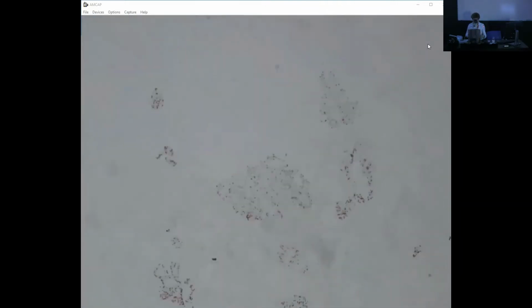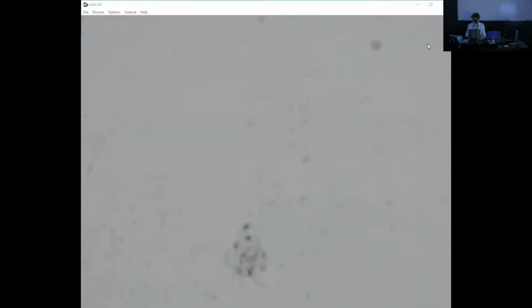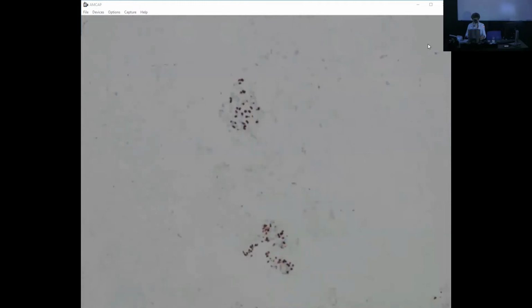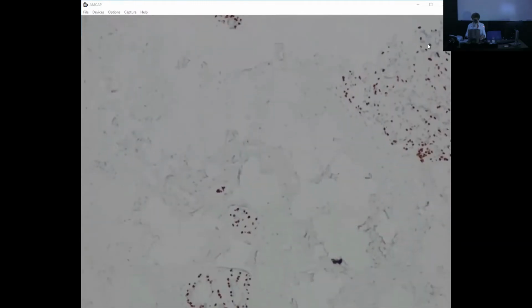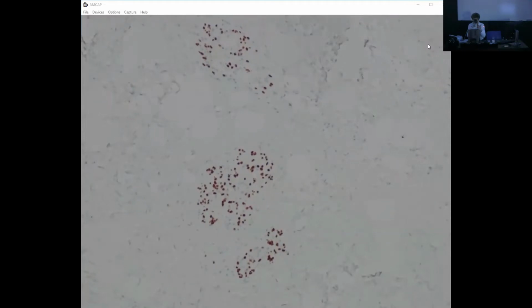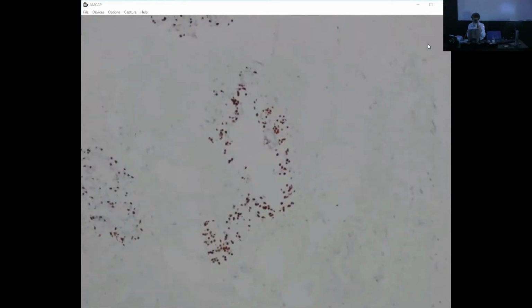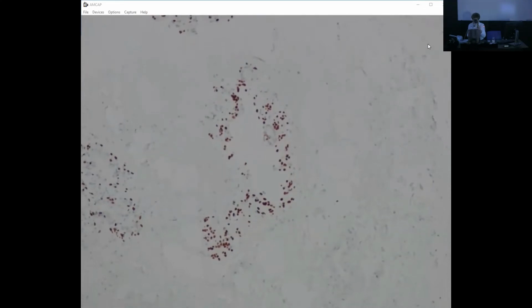Yeah, it's really very focal, seems to have been almost wiped out. But yes, there is myoepithelial proliferation, myoepithelial hyperplasia in this case, but no lobular neoplasia. Here is a good example. It's a demonstration of how sometimes the myoepithelial cells can mimic in some ways lobular neoplasia. This is an elderly patient. Sometimes we see that after radiotherapy, myoepithelial hyperplasia without lobular neoplasia, or in patients post-neoadjuvant chemotherapy.